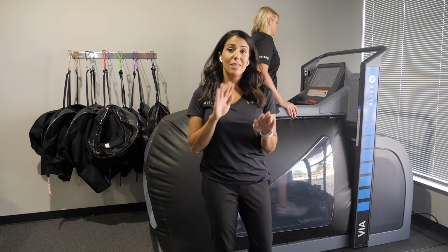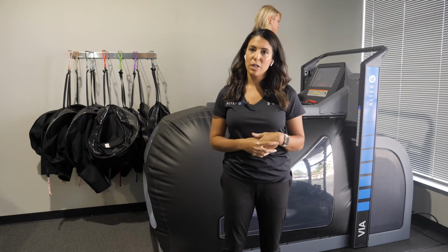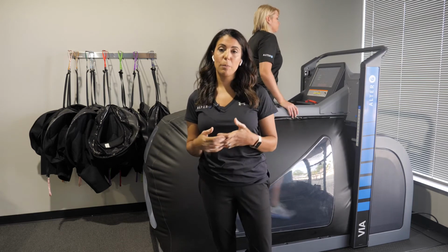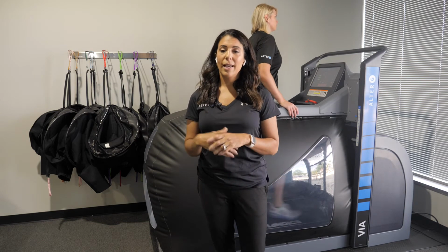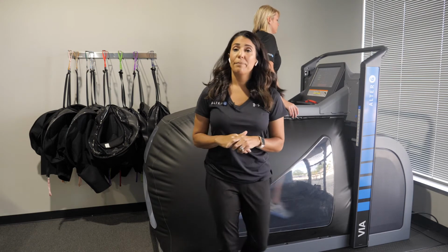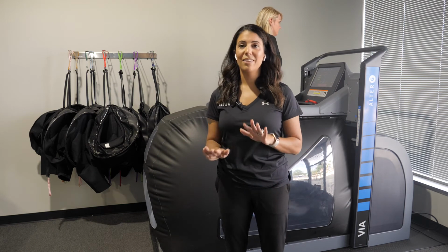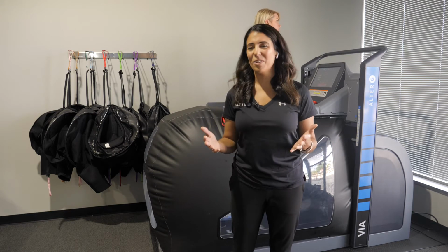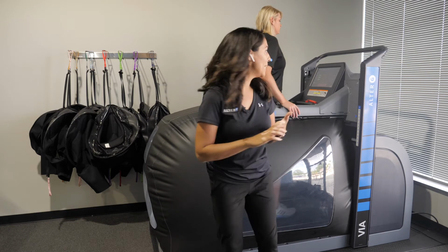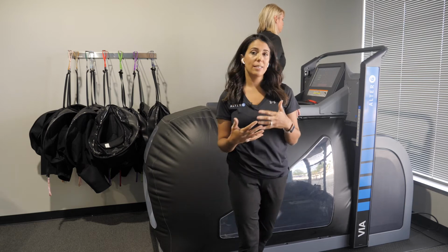On the screen, you can see these numbers changing live. They're an average of about 6 steps, 3 steps per each foot, and the numbers are changing. So again, this is some really great feedback for your patient to use while they're running or walking, to be able to see how symmetrical their gait is. The 4 parameters are weight bearing percentage, which gives you a percentage of weight bearing on the left versus the right. We would love it to be equal, but none of us are perfect 50-50. But it's really nice for your patient to work to get as close to 50-50 as they can. We can also look at cadence, step length, and stance time.